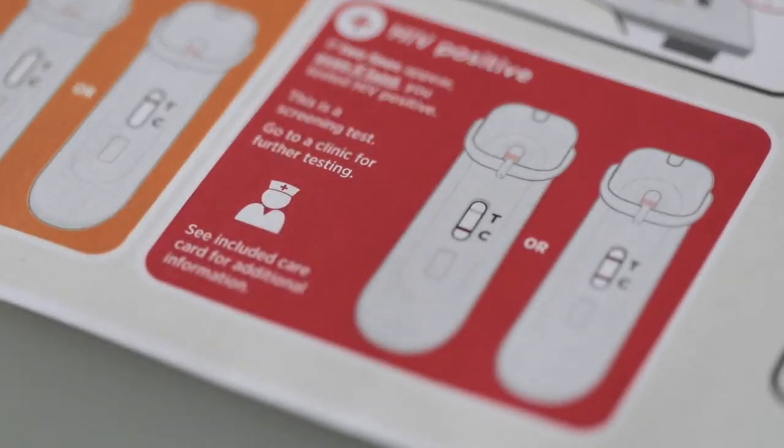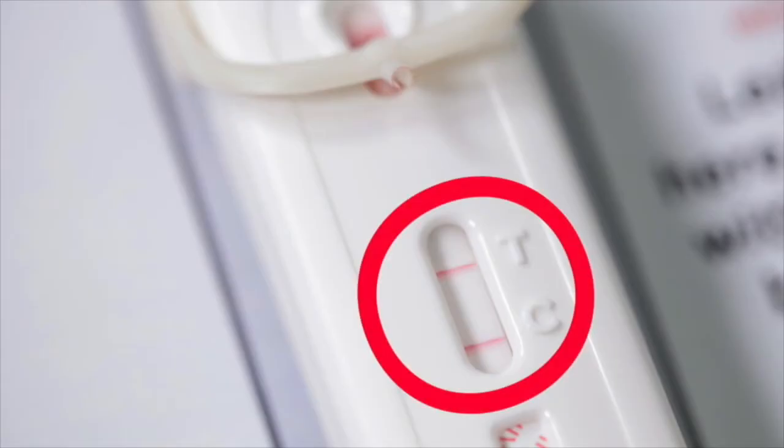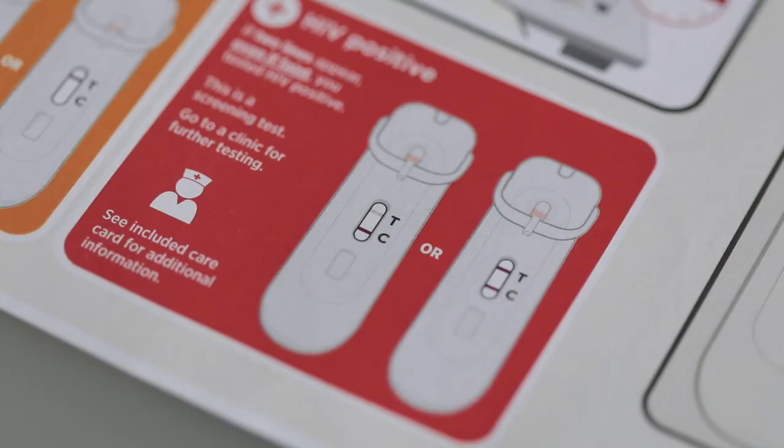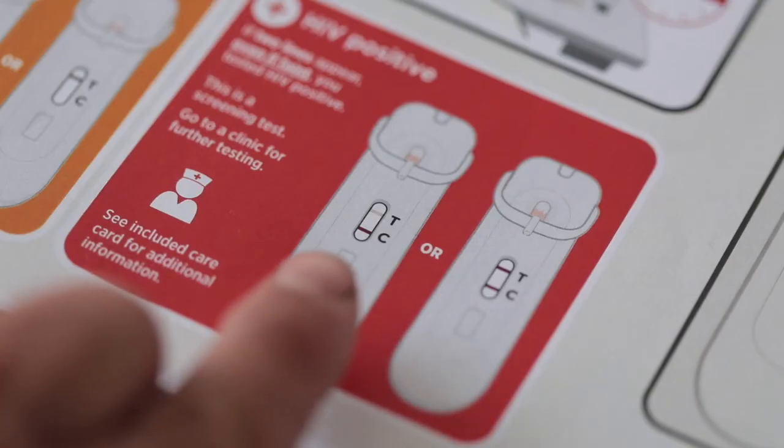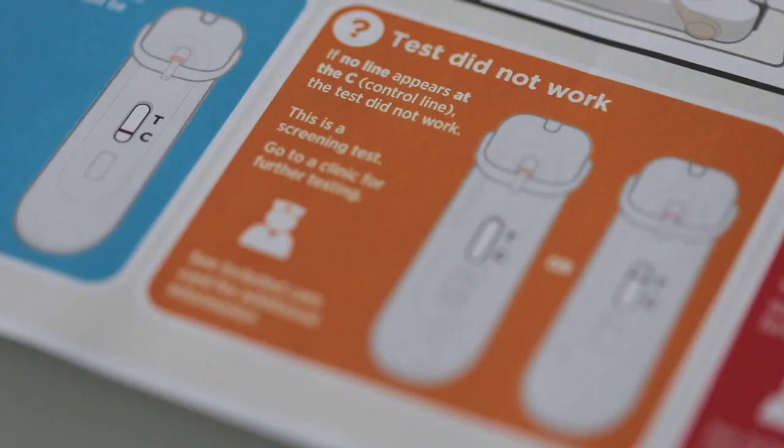Look in the red box called HIV positive. If a line appears next to the C and a line also appears next to the T, you have tested HIV positive, even if the line next to the T is faint. Because this is a screening test, it is important that you go to a clinic for further testing to confirm the result.